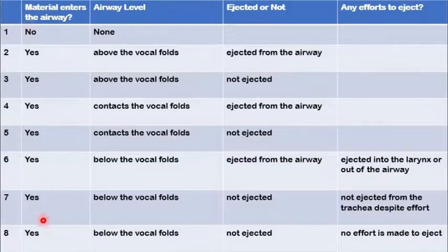Between 1 and 8, it goes into different levels according to the depth of the invasion.